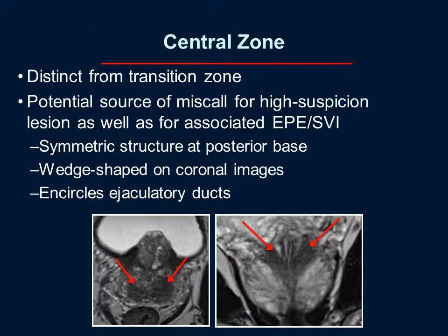So now I'm going to mention a number of potential diagnostic pitfalls that are important to keep in mind when interpreting the exam. These can be sources of possible overcall, and I'd list first and foremost the central zone, which for somebody with less experience or who is new to these exams can really present a challenge.